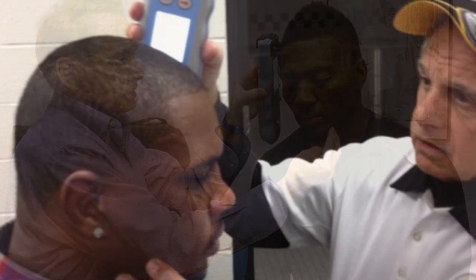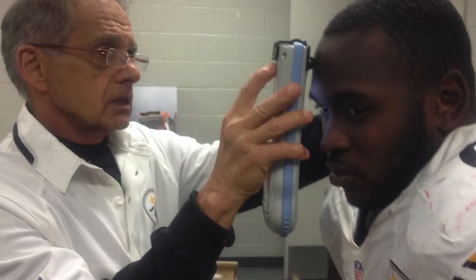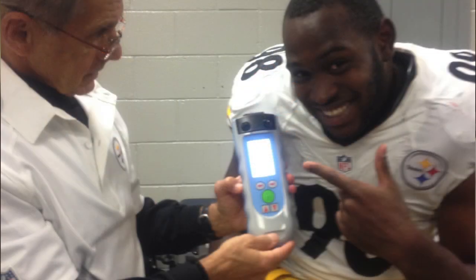As someone who has spent a long time in sports medicine, concussions have become a major component of managing athletes with head injuries. Concussions are sometimes — rarely, I might add — associated with intracranial hematomas. In the past we would routinely obtain CAT scans to rule out that possibility. I've been able to use the Infrascanner in sports medicine with professional and college football players, evaluating them for concussions concurrently, to satisfy myself that a CAT scan would not be indicated and that clinical evaluation and further judgment would be more appropriate. We've been able to use this as a triage instrument to more effectively utilize CAT scanning in athletes with concussions.